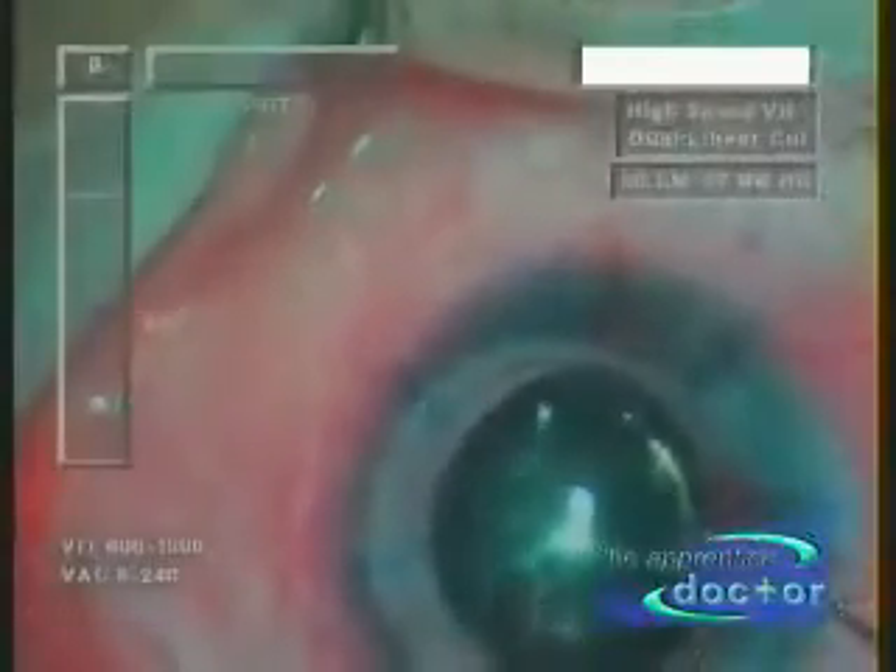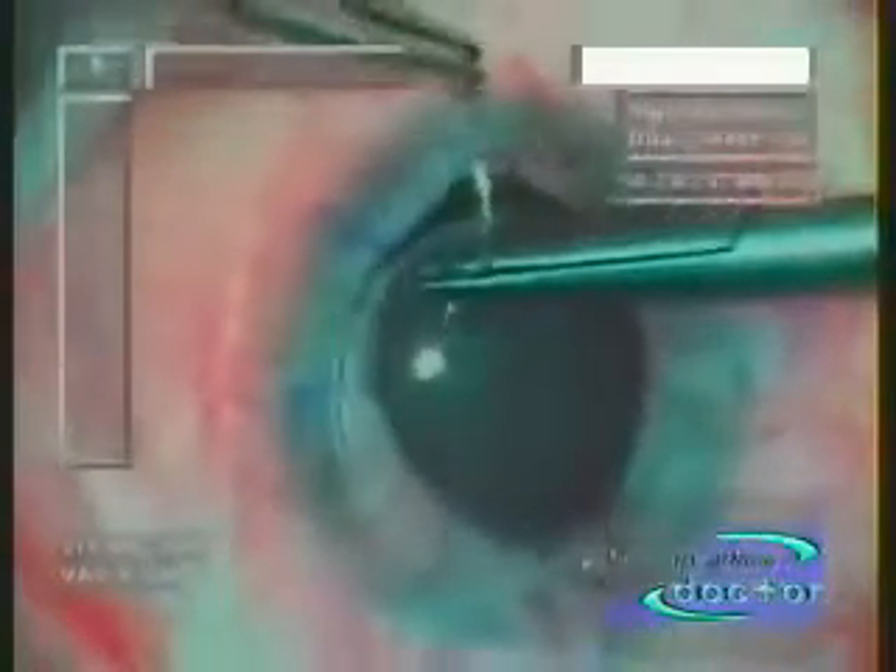A specially designed microneedle holder and tissue forceps is utilized to suture the new cornea into position. The eye surgeon uses the markings to ensure correct placement of the new cornea.